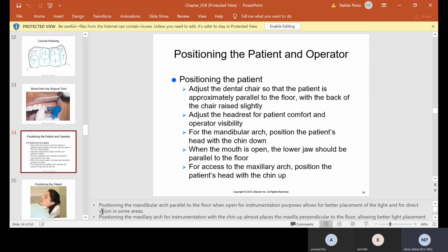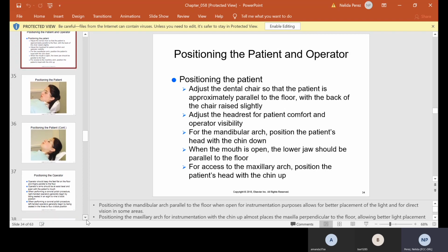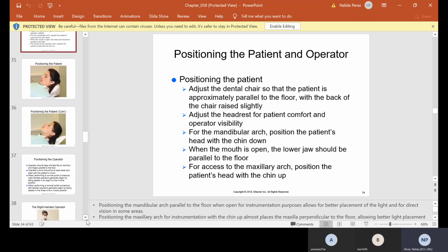You want to position the patient by adjusting the chair so that the patient is approximately parallel to the floor with the back of the chair raised slightly. Adjust the headrest for patient comfort and operator visibility. For the mandibular arch, position the patient's head with the chin down. When the mouth is open, the lower jaw should be parallel to the floor. For access to the maxillary arch, position the patient's head with the chin up.